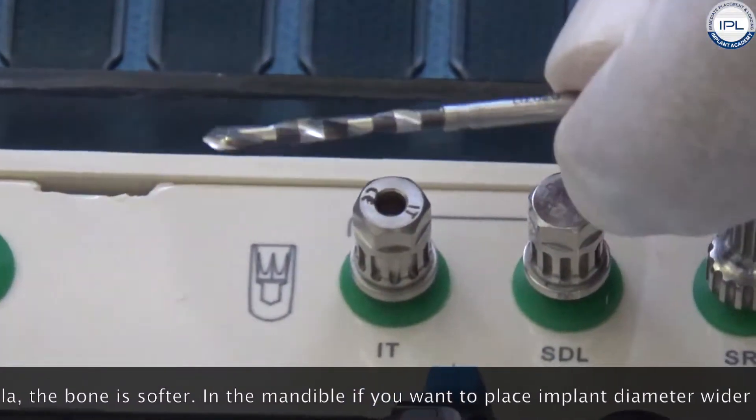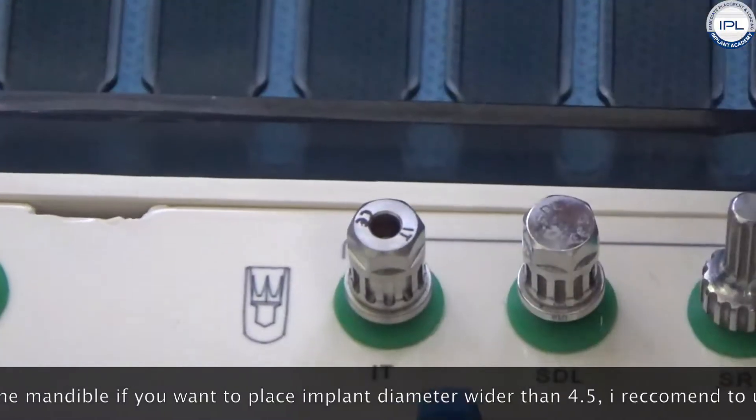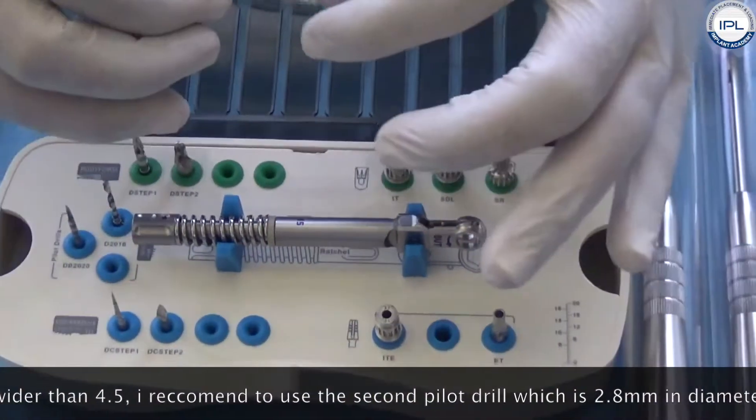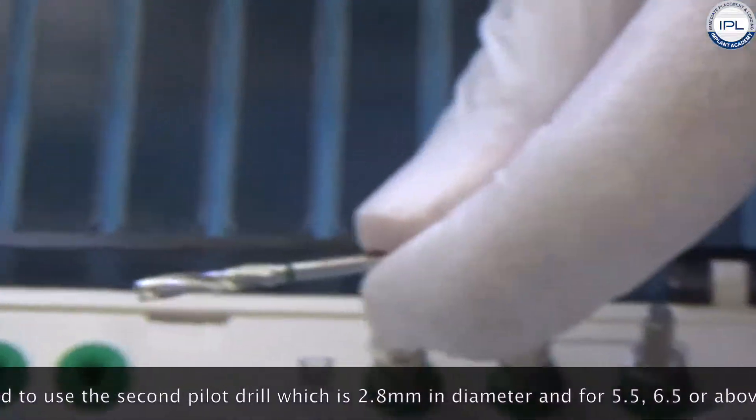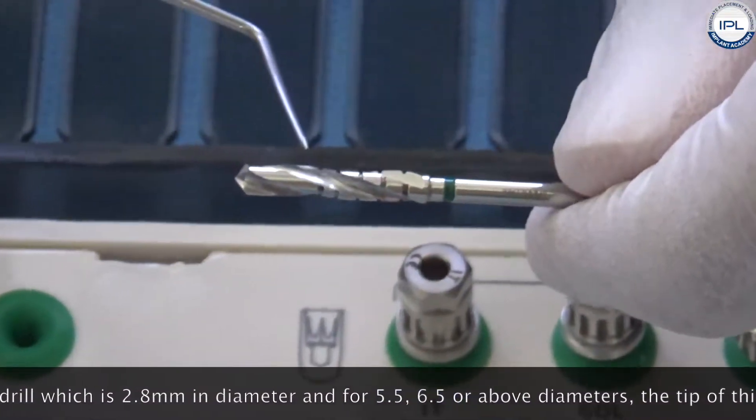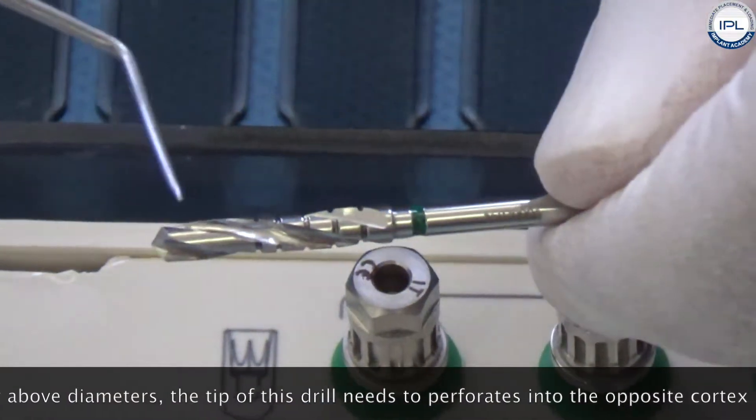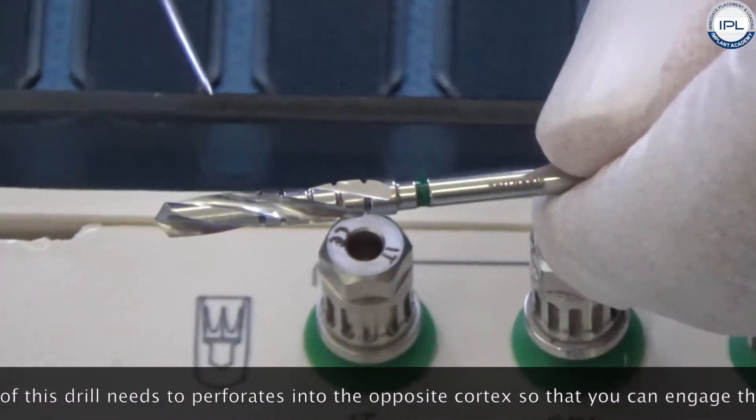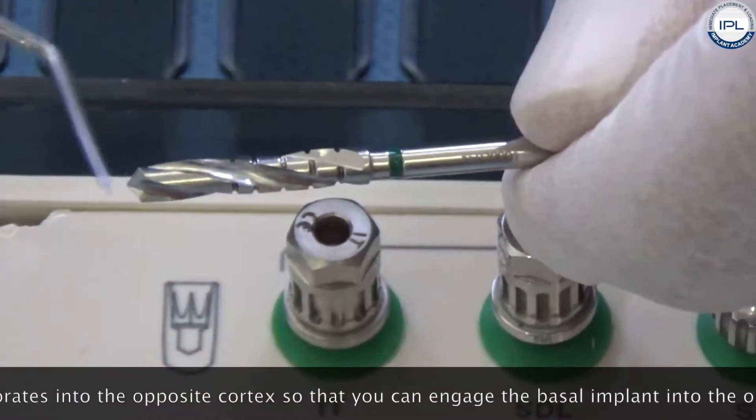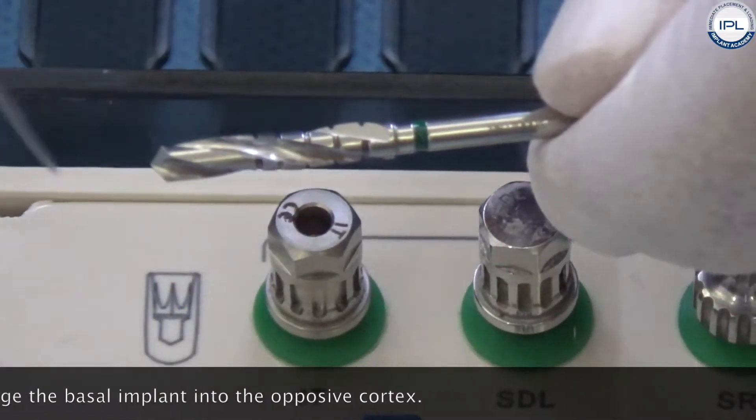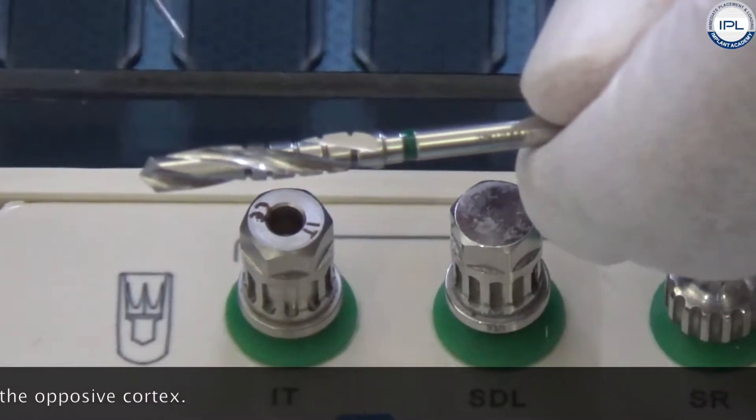In the mandible if you are going to place implant diameters wider than 4.5, I recommend you get this drill. This is the second pilot drill. This is 2.8 millimeters in diameter and for 5.5, 6.5 and above diameters, the tip of this drill needs to perforate the opposing cortex so that you can engage the basal implant into the opposing cortex.